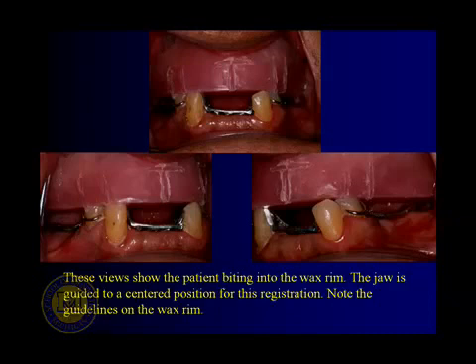You remember blocking out your master cast when you made your record base so you didn't abrade it? So you didn't put block out everywhere, but you put some block out wax on the rugae areas. You put it in the undercut, so as you made your record base and took it off and on the cast, you didn't abrade or break the model. So when they make the real denture, to get the cast of the finished denture off the model, they destroy and disintegrate the model. They break the model away. Okay, so now the denture will go in the mouth and it'll fit into some of those undercuts because soft tissues give a little bit, unlike the stone cast.